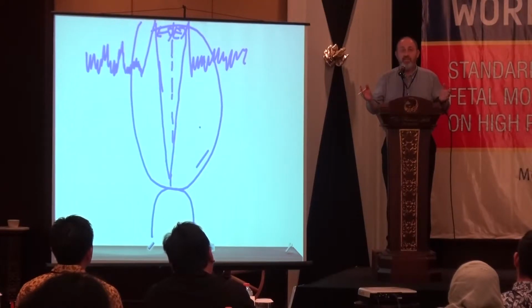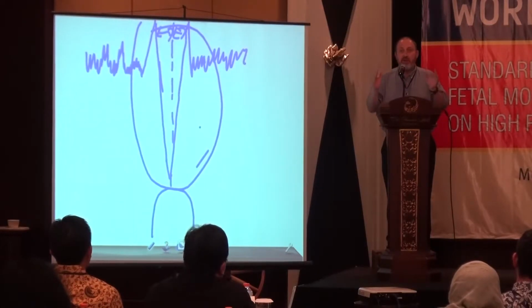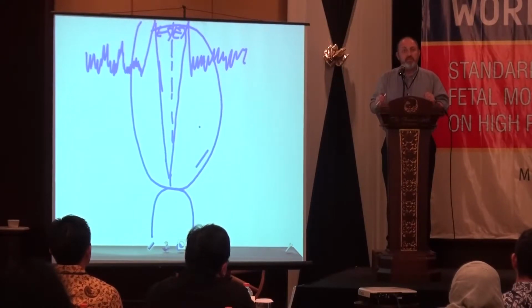Yeah? Everybody happy with that? So you just all agree that it can occur anywhere in the contraction phase. So therefore, it can occur with the decelerations. Do you all agree with that?